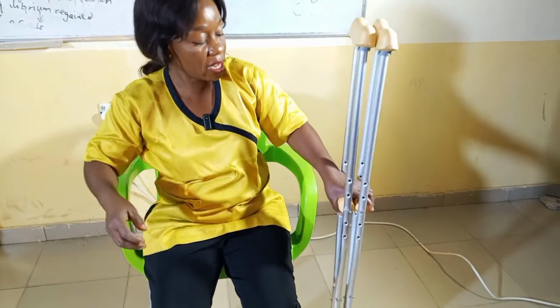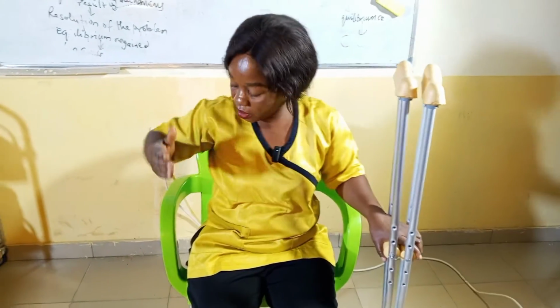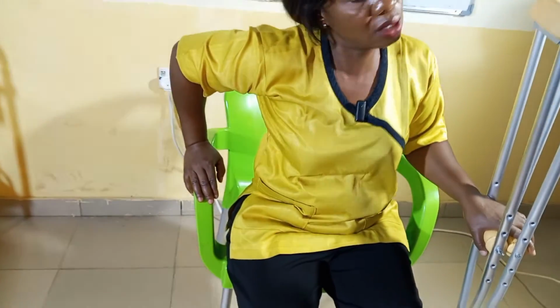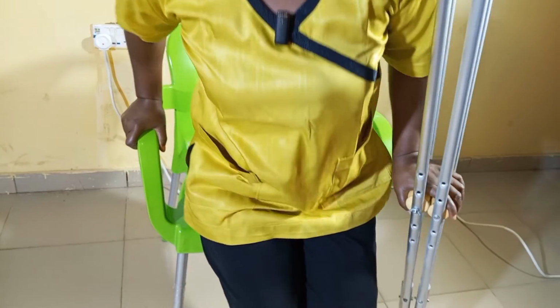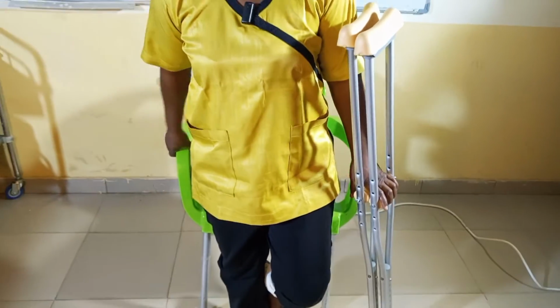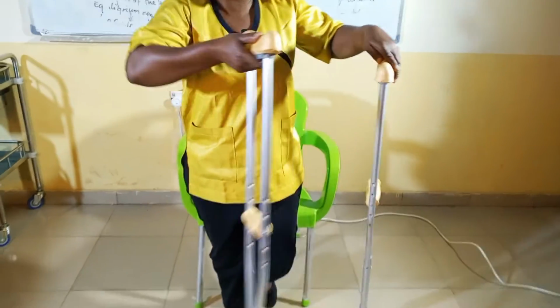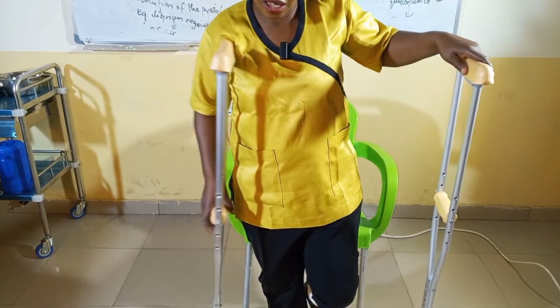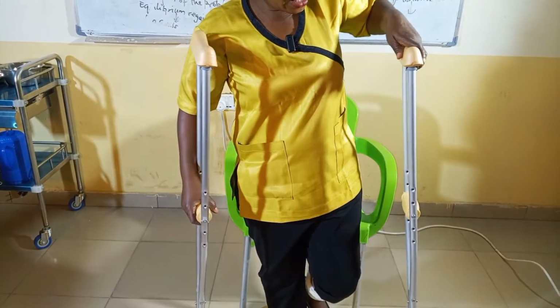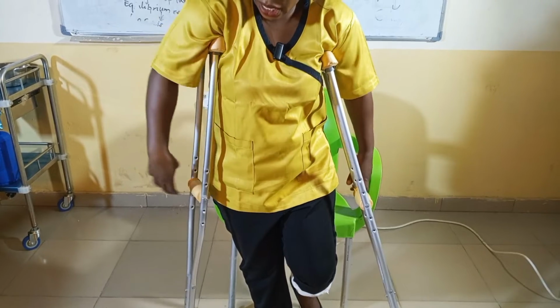Place your non-dominant hand on the handle and support yourself on the armrest of the chair and lift yourself up. Let the patient stand up and immediately separate the crutches. Let one be in the non-dominant hand and the other in the dominant hand, right?